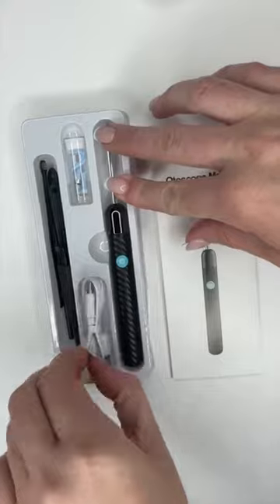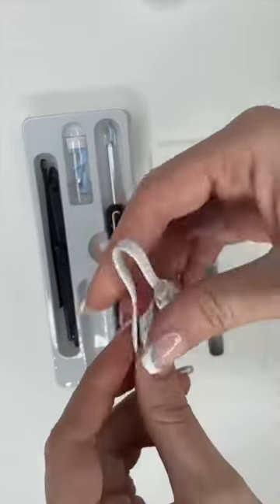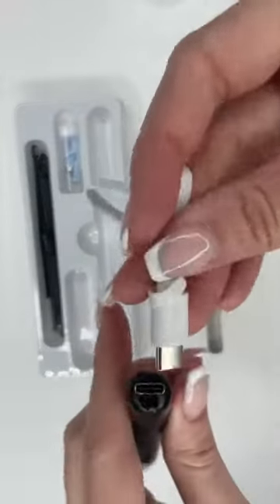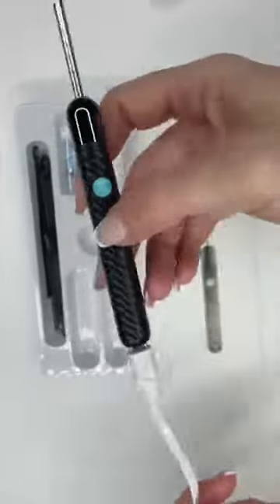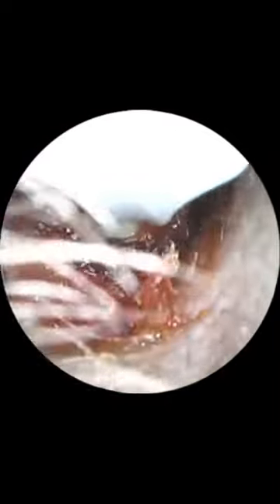It also comes with a USB charging cord — you plug that into the ear curette, then use the other side to plug into a USB adapter. It was very easy to pair it to my phone through your Wi-Fi settings. Check out this image quality — for only $29 on Amazon, I was very pleased at the quality of the video and the overall ease of use.